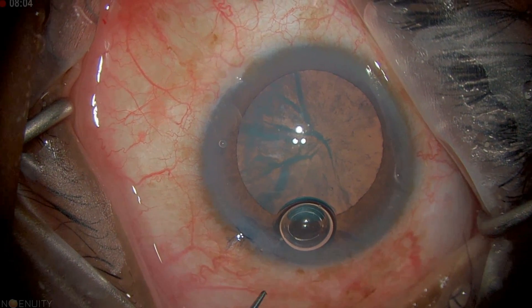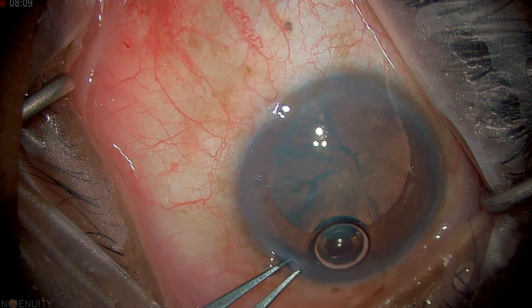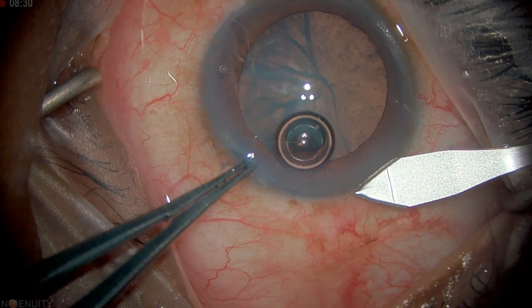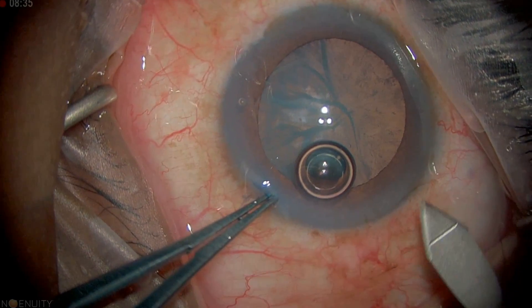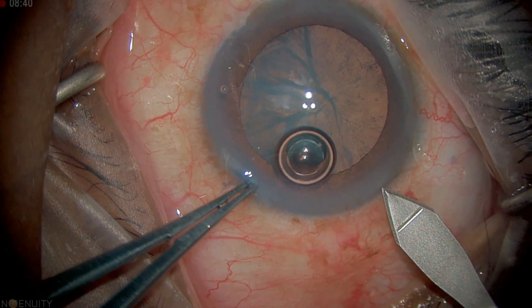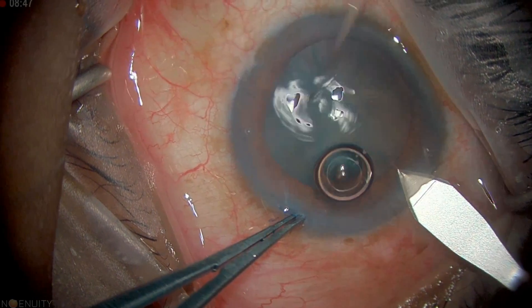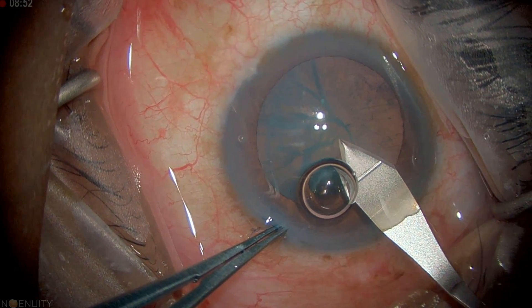I like the 0.12 forceps and I'll use the single tooth just inside the side port wound. I'm not grabbing endothelium and I will score the epithelium just at the limbus — that gives me an initial placement for my keratome. A lot of these keratomes are marked, and you can see the mark on this keratome showing you where you have to advance into the cornea before turning the corner and entering the anterior chamber, giving you a biplanar effect.